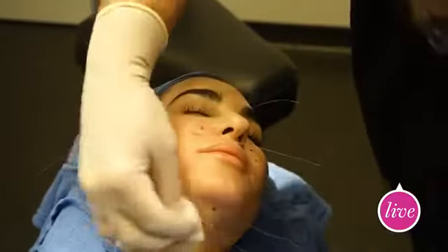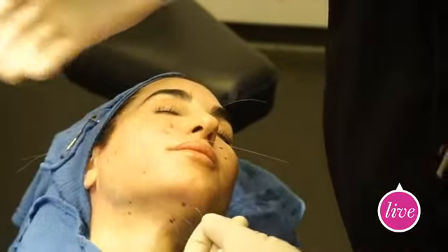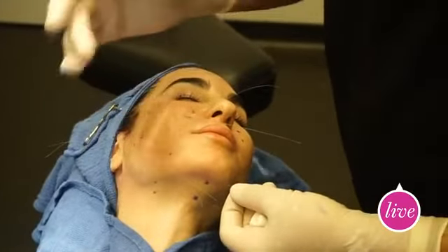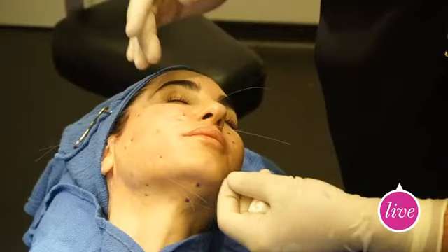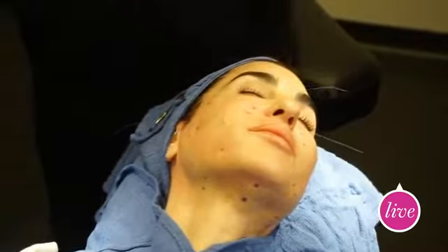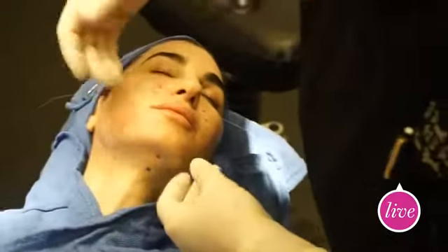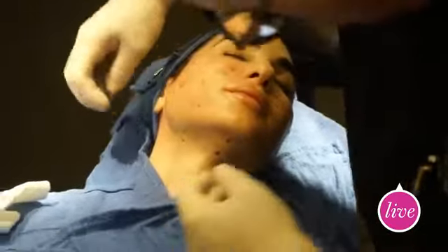And then the last set of sutures I will use in the neck. Now, this is approved by the FDA in the U.S. for mid-face elevation. So my use in the neck is what's called an off-label use, which is of course allowed by the FDA. But you do have to have experience. I also teach a lot of physicians how to use this device. But first, we make sure that everybody's very comfortable using it in the mid-face before they advance to the neck.